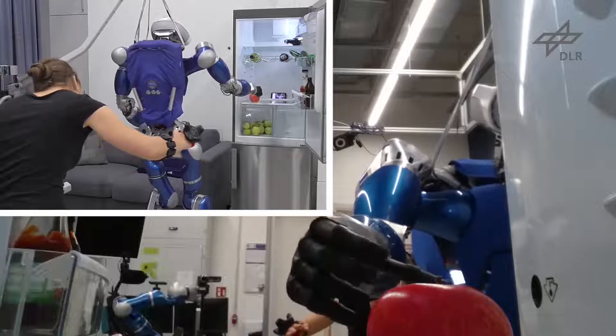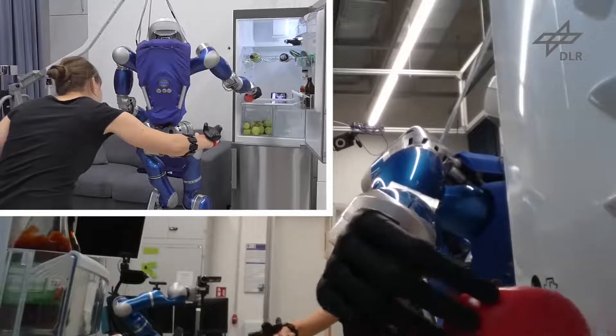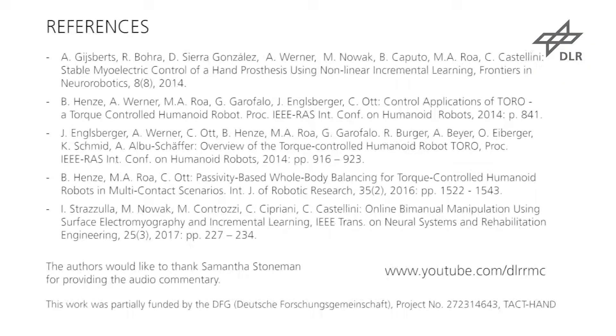The demonstrator is relevant for patients with upper limb impairments, as they lack proprioception and rely mostly on visual feedback to perform tasks. The technique provides natural and reliable control of dexterous hands.